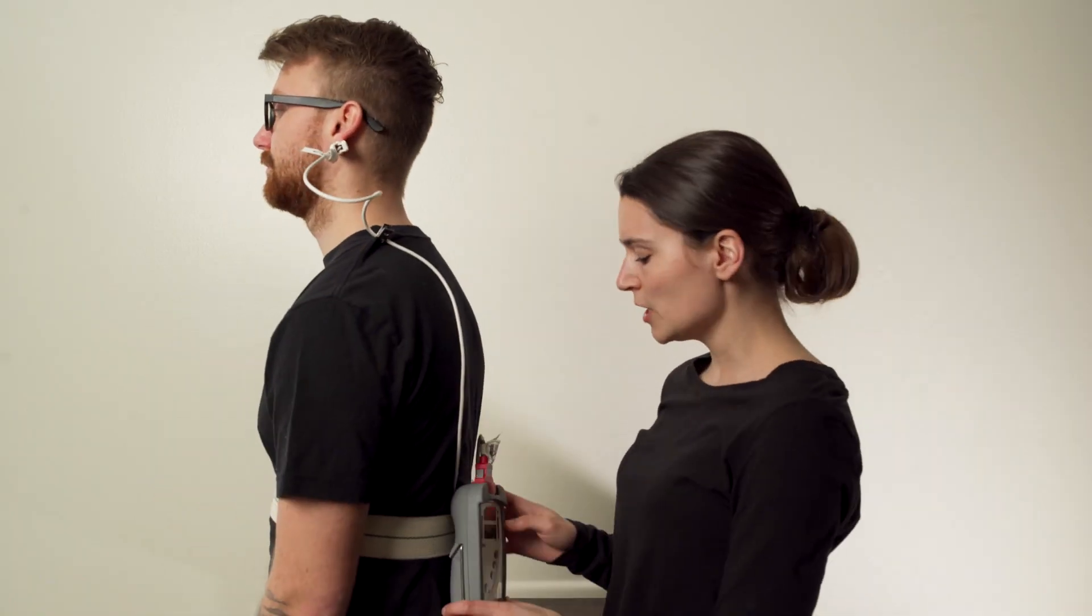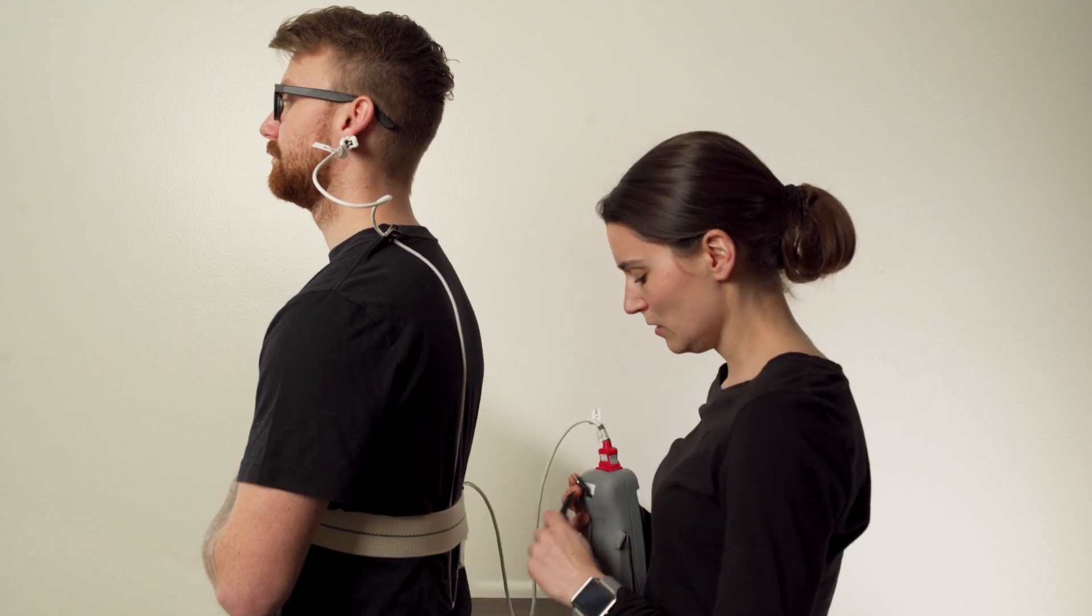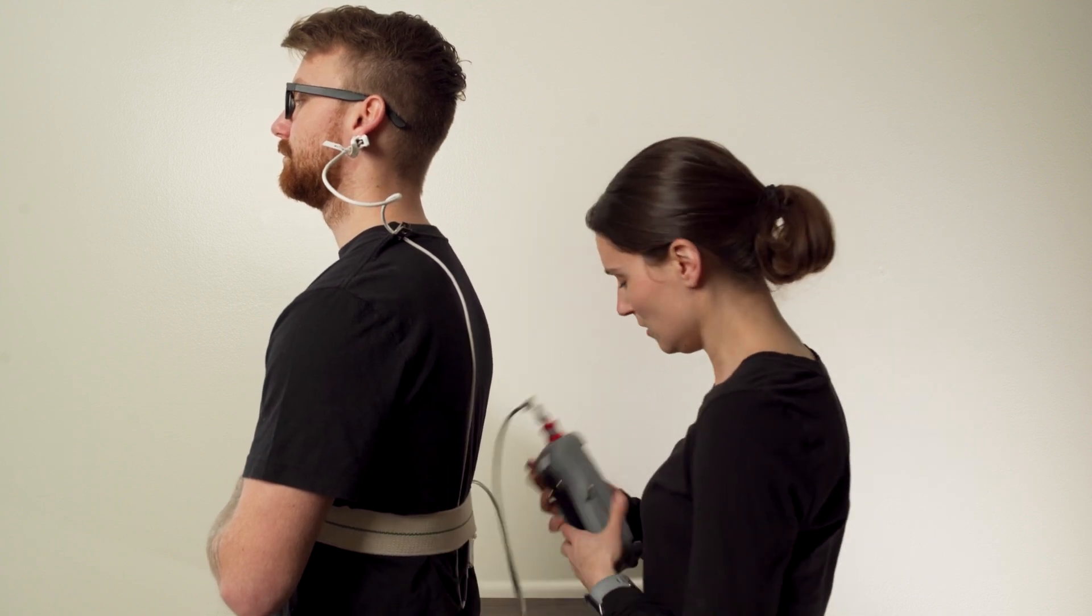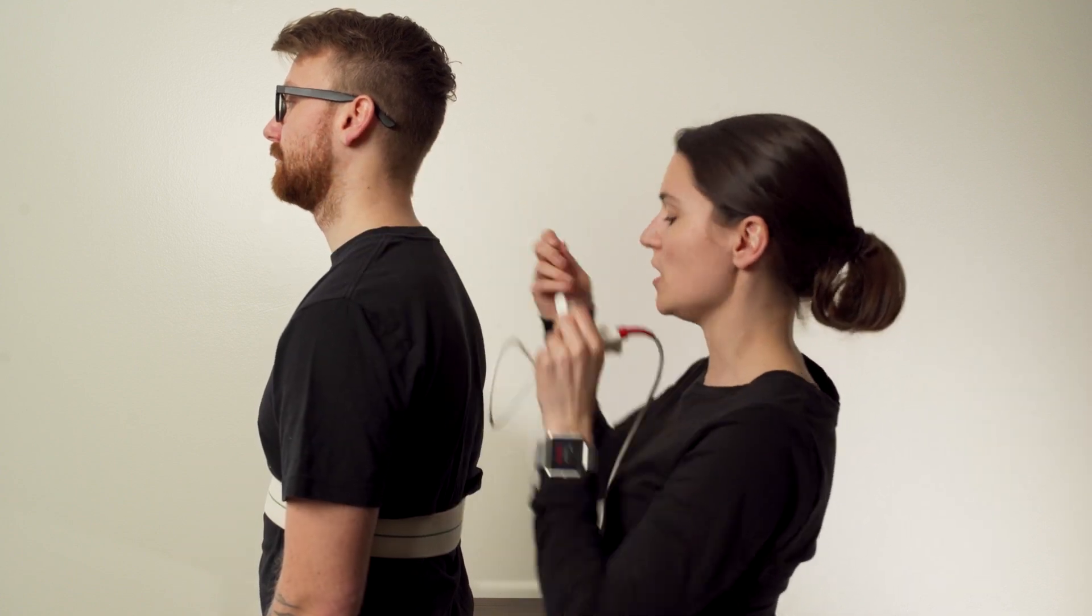Once you're done working with the patient, you'll remove the system from the gate belt. Take the clip off the shirt and the sensor off the ear.